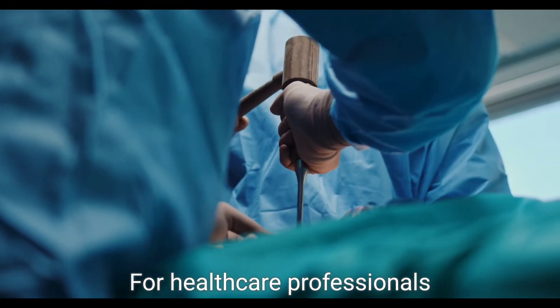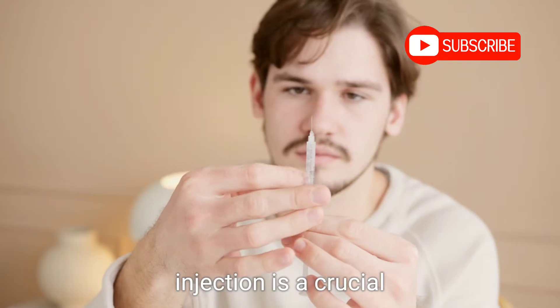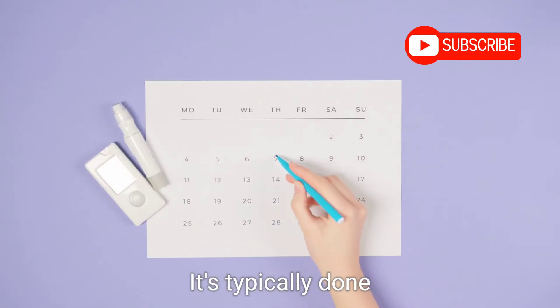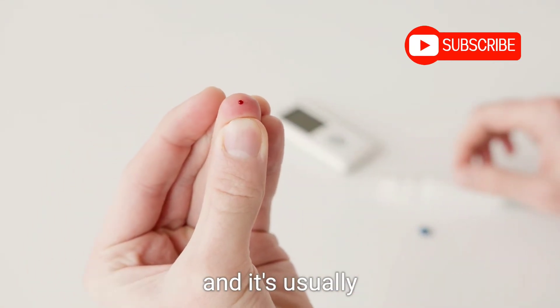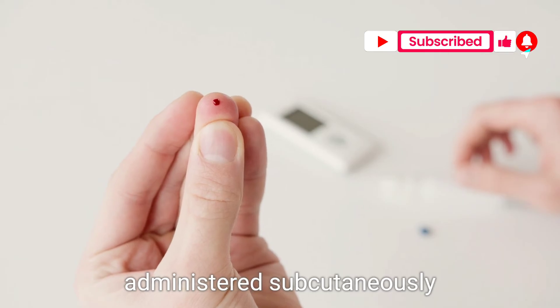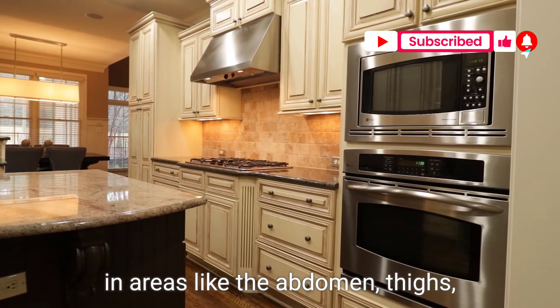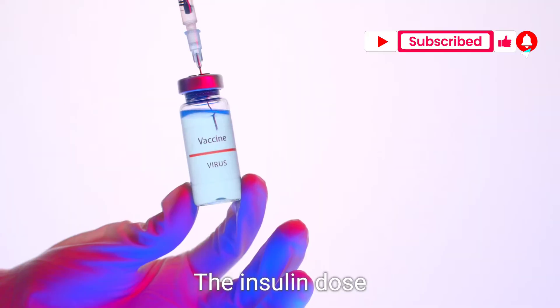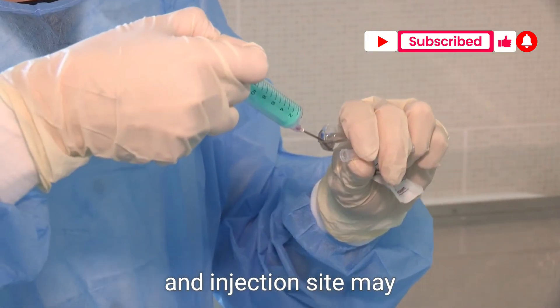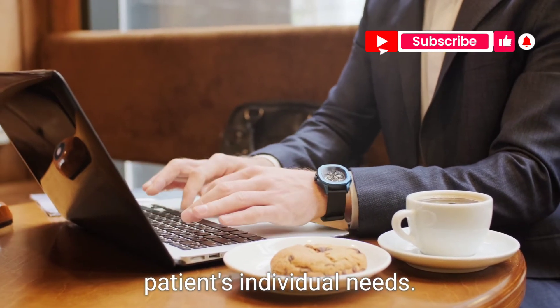For healthcare professionals and trained individuals, administering insulin through injection is a crucial part of diabetes management. It's typically done using an insulin syringe, pen, or pump, and it's usually administered subcutaneously under the skin — in areas like the abdomen, thighs, or buttocks. The insulin dose and injection site may vary based on the type of insulin and the patient's individual needs.